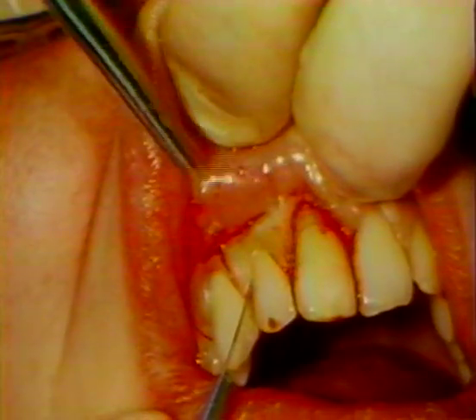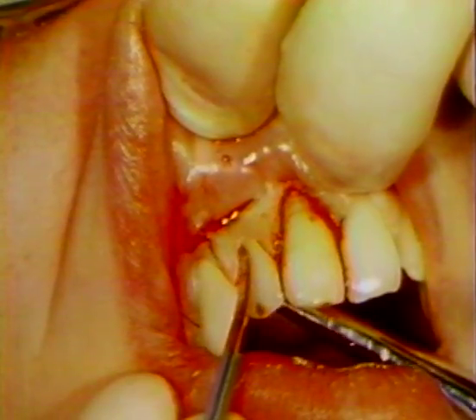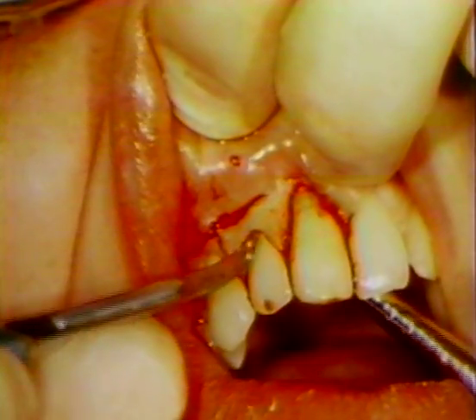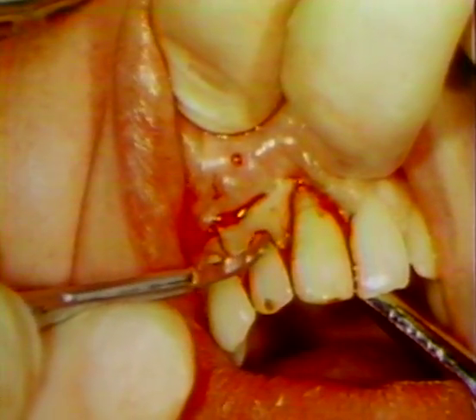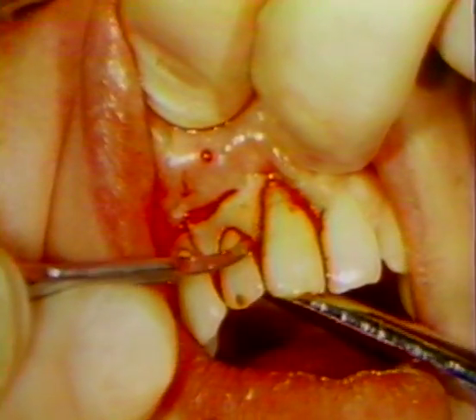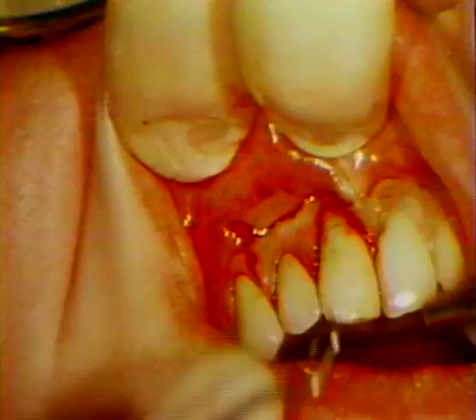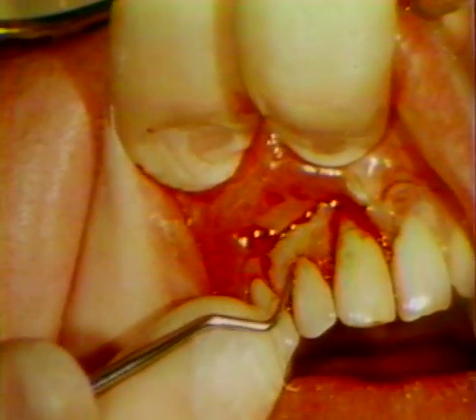The final incision to free the gingiva from the lateral incisor is made along the bottom of the gingival crevice and carried down to the alveolar process on the labial aspect of the tooth. The curette is again used to free any residual attachments.